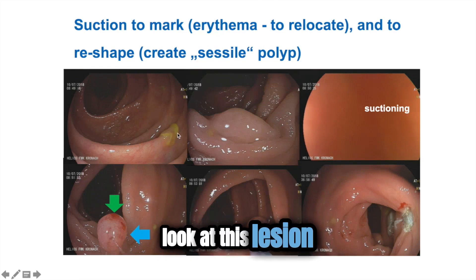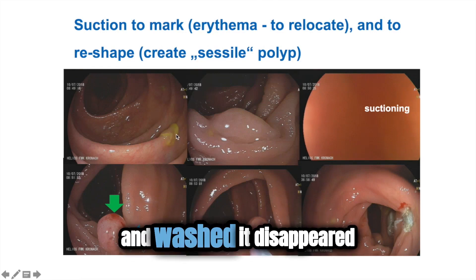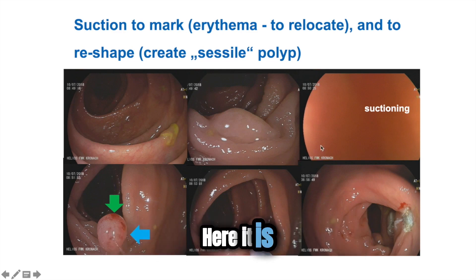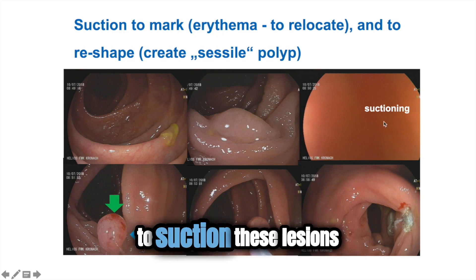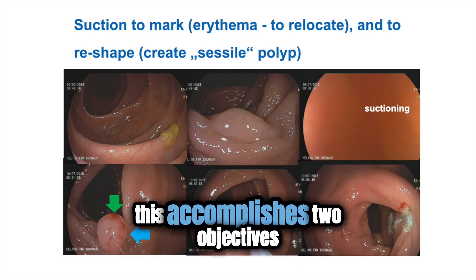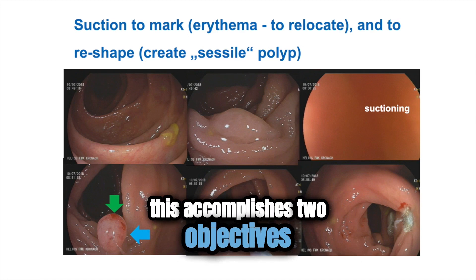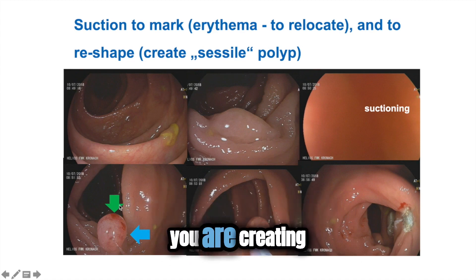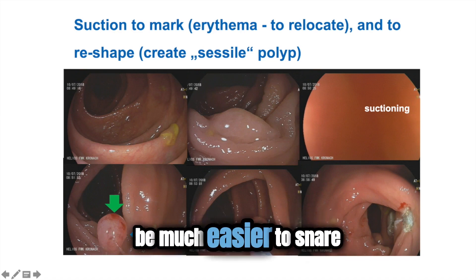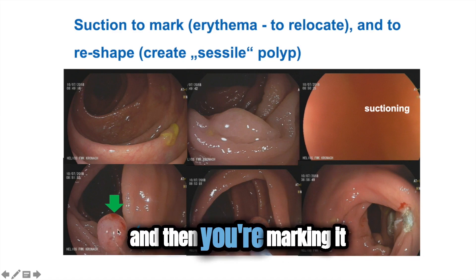For example, look at this lesion. Once it was cleaned and washed, it disappeared, but we found it again — here it is. I like to suction these lesions into the endoscope because this accomplishes two objectives. Number one, you are creating from a flat lesion a sessile lesion — a sessile polyp — which will be much easier to snare. And then you are marking it.